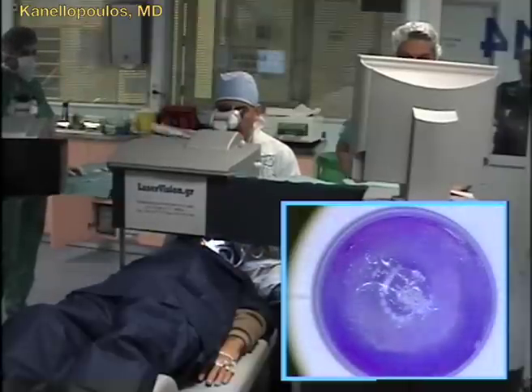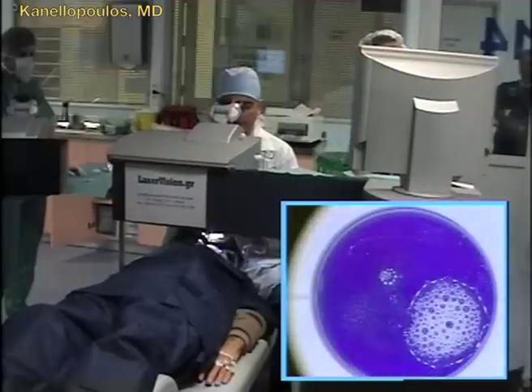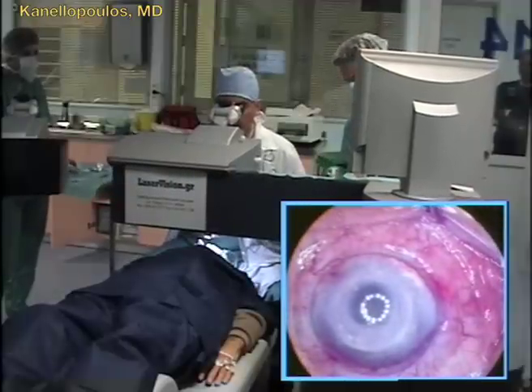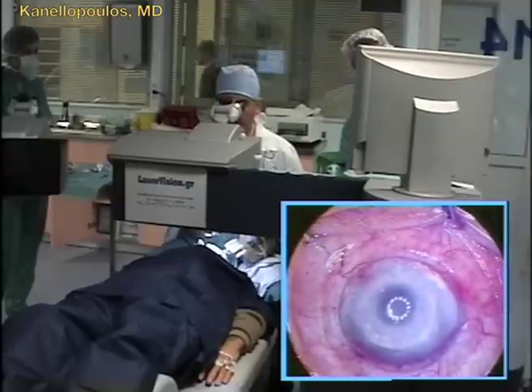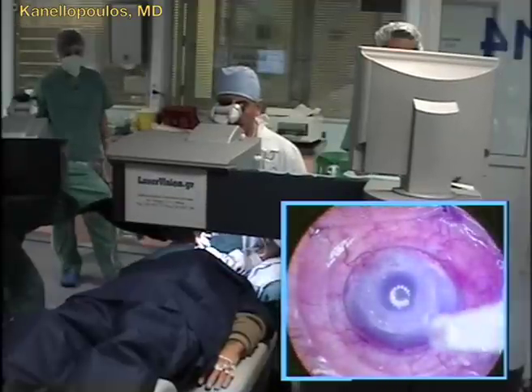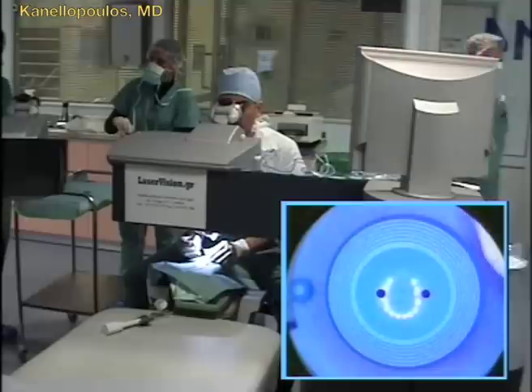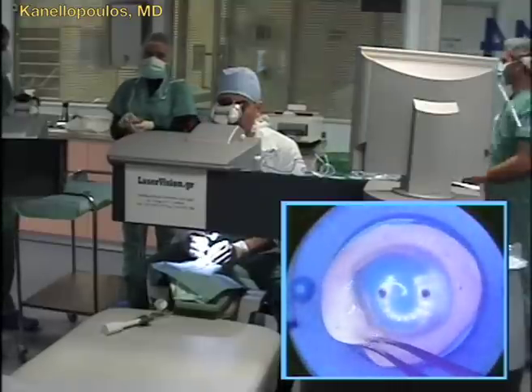We will throw away this PI, dispose the PI, and then go with a new PI onto the donor tissue. We use excellent donor tissue from the Denver Eye Bank, the Mountain Lion's Eye Bank. This is a catena disposable anterior chamber.